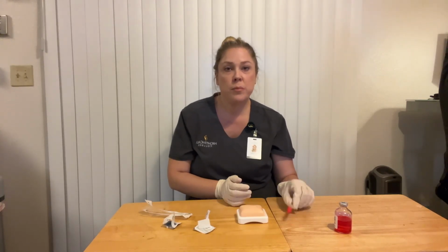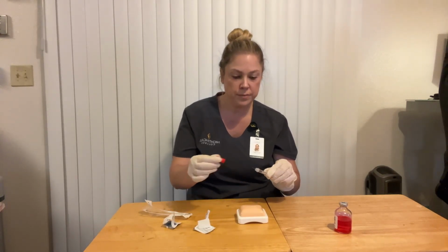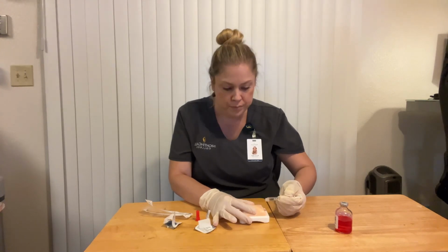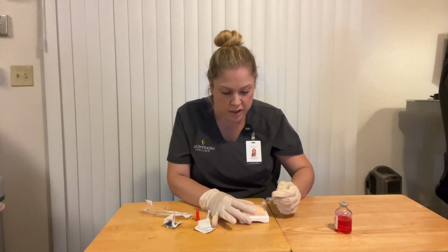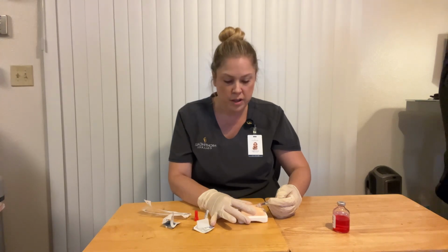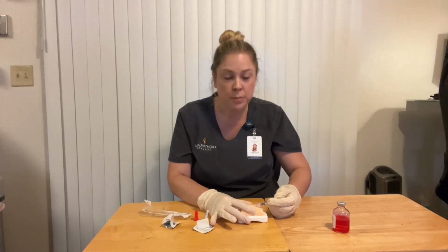I would then remove the top of the needle, stretch the skin, point the bevel of the needle up. I would then inject at a 5 to 15 degree angle through the dermis, about 3 millimeters below the skin's surface. Note that we can still see a bulge from the needle tip below the skin, since we're not very deep.